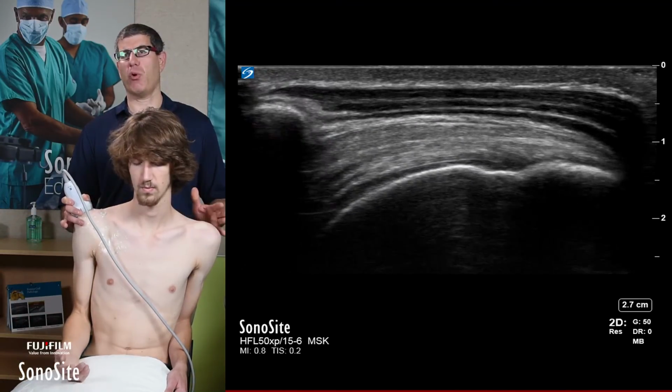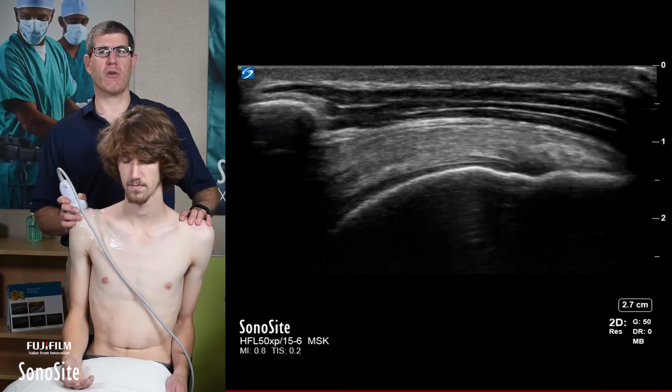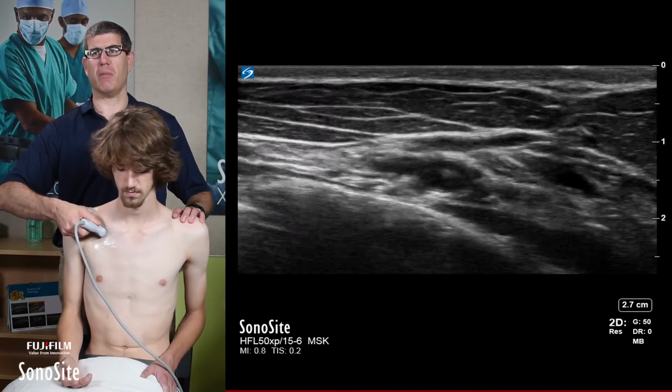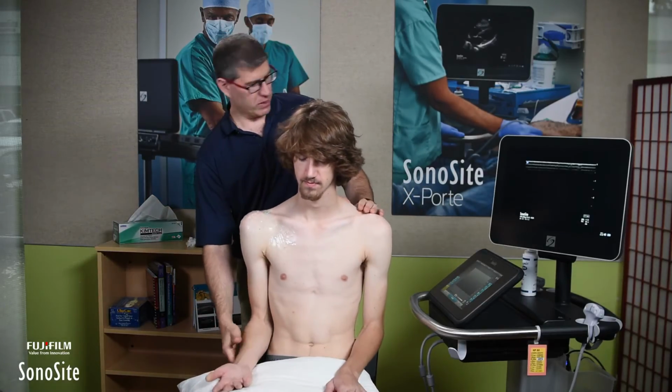And for me, that's really important. Usually this combination of focusing on supraspinatus impingement and whether I can correct that with scapular retraction, combined with looking at shortening of the pec minor, gives me a lot of information about whether or not I can have this patient rehabilitated. All right, so next thing I'm going to do is have you go back into that baseline position.